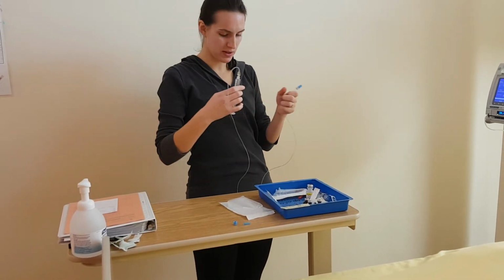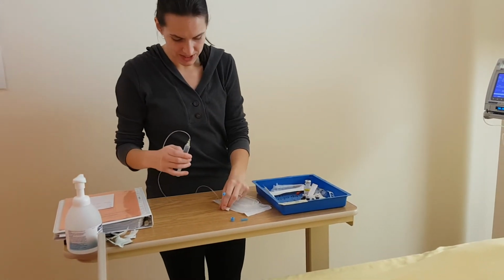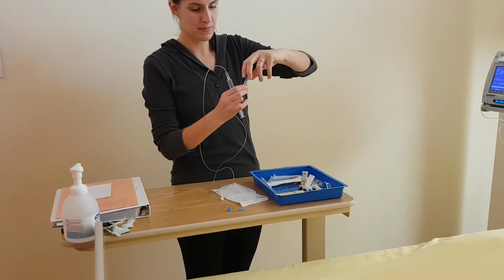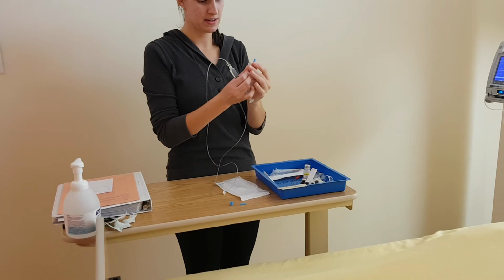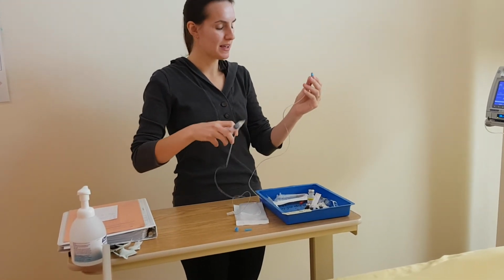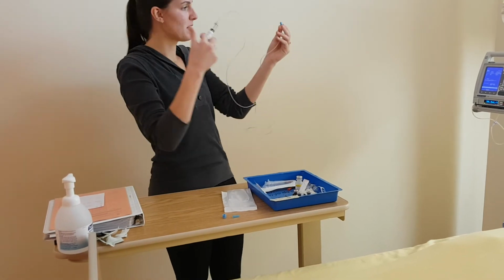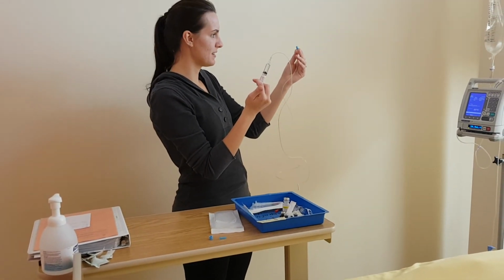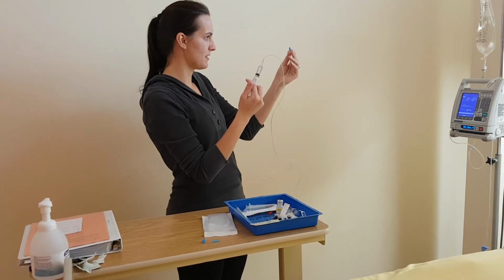At this point, I'm going to make sure my clamp is open, which it is. I'm going to hold this, again being careful not to touch either end, and I'm going to forward prime my medication. So I'm just watching for a little blend at the end of this. Now I'm just going to gently roll this just to make sure that the medication disperses. Okay.